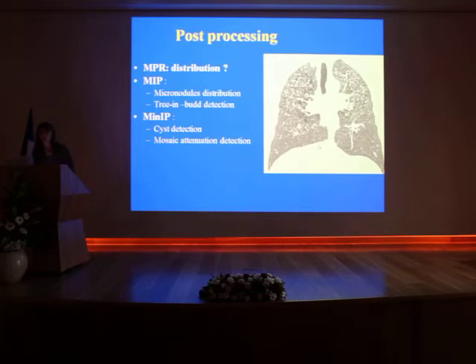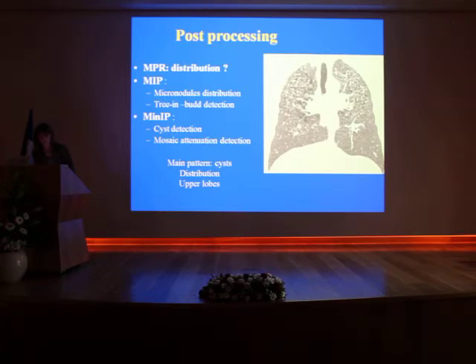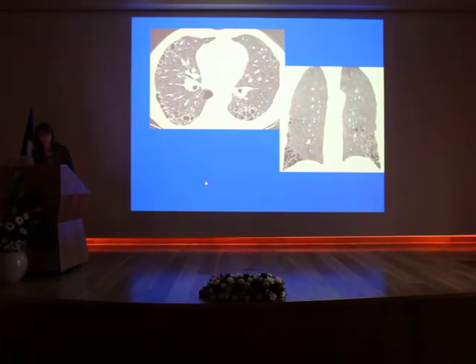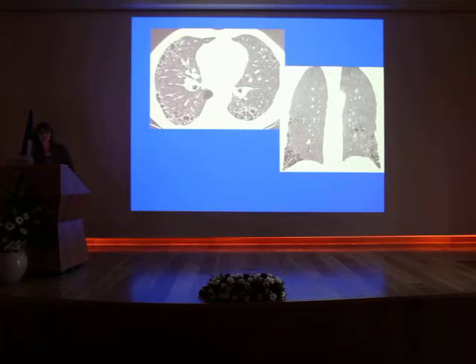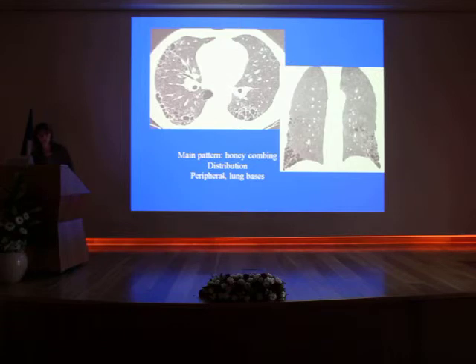Looking at this coronal reformation, the main pattern is cysts. There is upper lobe predominance, the cysts are not rounded — they have an irregular, bizarre shape. This is Langerhans cell histiocytosis. In this next case, the main pattern is several layers of cysts at the lung periphery — honeycombing. The distribution is prevalent at the lung base and it is peripheral: this is UIP, and in this case the patient had lupus.